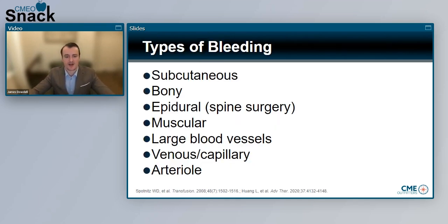I do want to go into the types of bleeding. All right, so we have subcutaneous bleeding. Okay, now typically that's approach related. Electrocautery is great for this. Retraction, mechanical compression are the best agents. And I would say a mechanical active combination for inactive surgery sites. What do I mean by this? That means I've already dissected that area. I'm no longer there. There's a little bit of muscular bleeding or subcutaneous bleeding that I can't control with electrocautery. I'll typically place a flowable or a Surgicel with a gel foam soaked thrombin in that region so I can prevent bleeding.